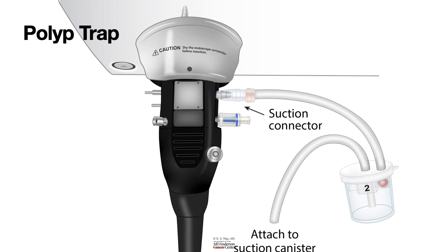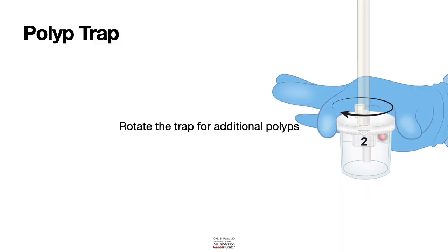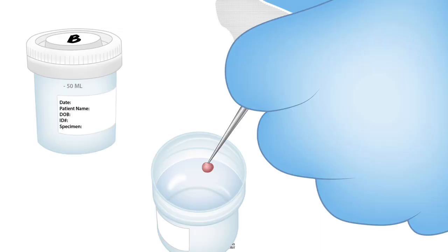So if multiple polyps need to be removed, all you need to do is, once you collected one specimen, you could rotate and move it to the next container to collect the next specimen. After all the chambers in a polyp trap are filled up, you can disconnect and transfer the specimens into a formalin jar, and each jar labeled according to the site from where the polyp came out.